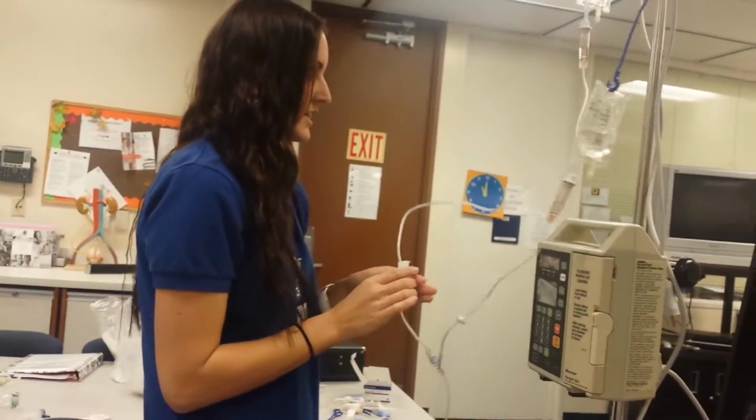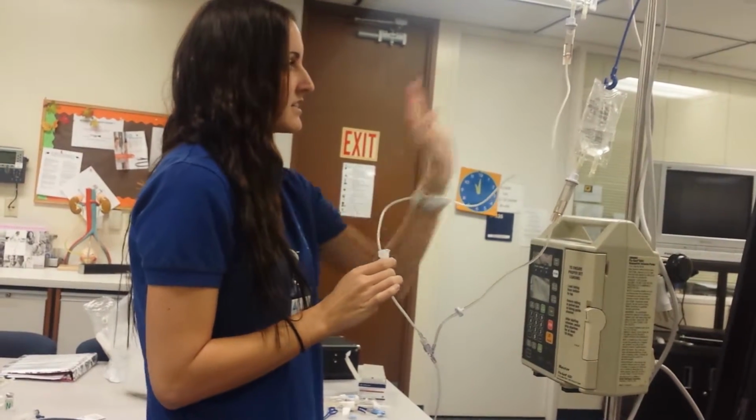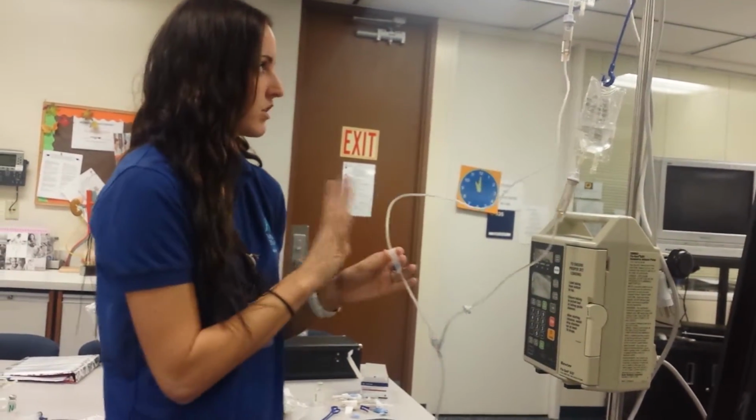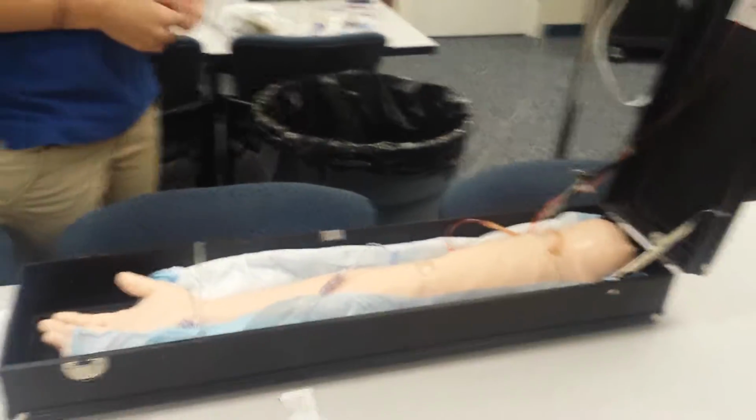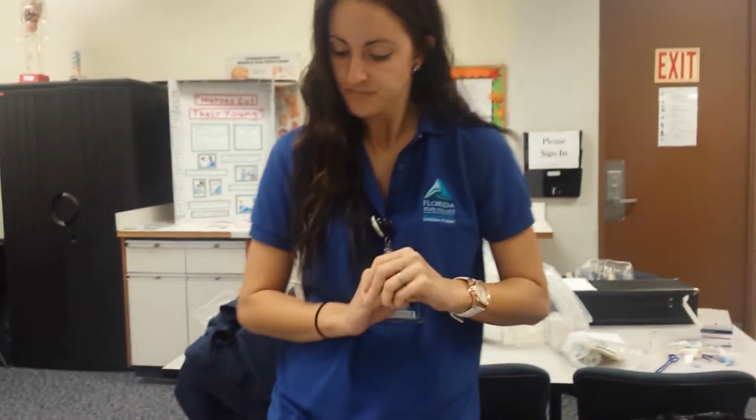So we need one every 7 or 8 seconds, like we said earlier. And once I have it at the correct rate, it's running smoothly, I'm going to leave it here, watch it for just a second, make sure nothing happens to occlude it and that it's going to run while I'm gone. So I'll check on it periodically, and I'll come back when it's done.